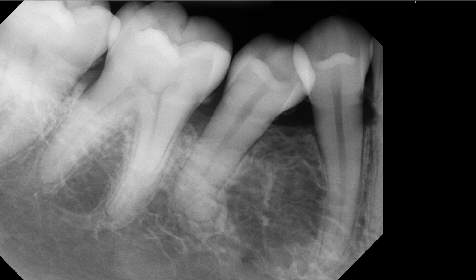You will notice that number 29 is mesially tipped, and the interdental or interradicular distance between the 28 and 29 is relatively wide, and you're seeing this radiolucent area. My question is: is there a space-occupying lesion in this area or is there not? Is there a lesion in this area or not? In order to answer that, you will have to evaluate the internal structures of this radiolucency.